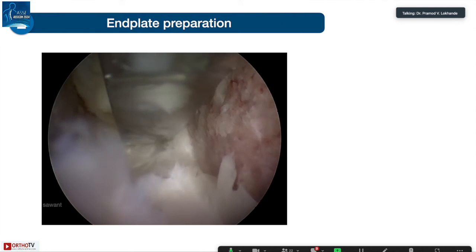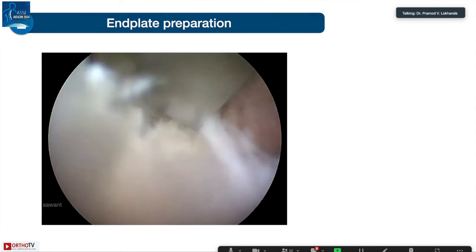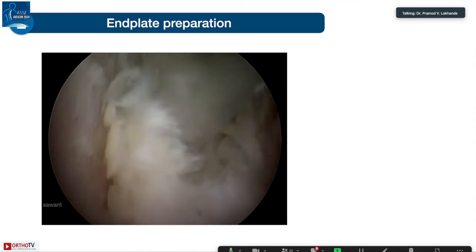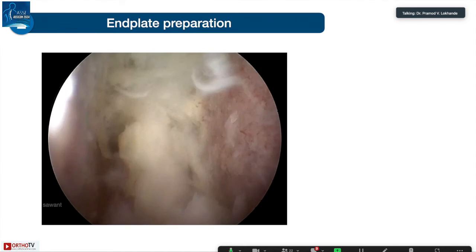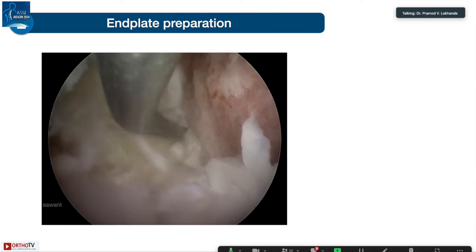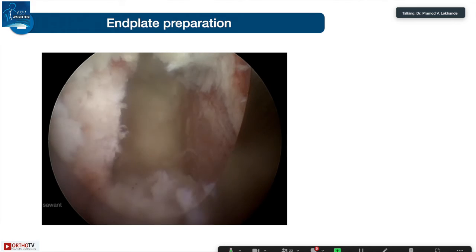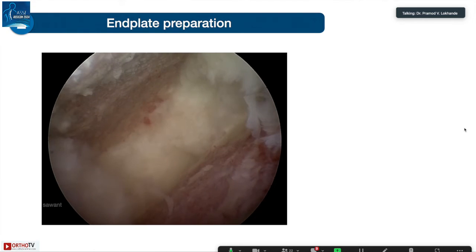Special curettes, that's the anterior annulus. You don't have to take a C-arm photo for this to identify where you are located. You can just see the difference of the tissue, and you can directly note that we have come close to the anterior annulus. So this is very safe in avoiding damage to the anterior annulus, especially in cases of infections where there is a very thin anterior annulus.